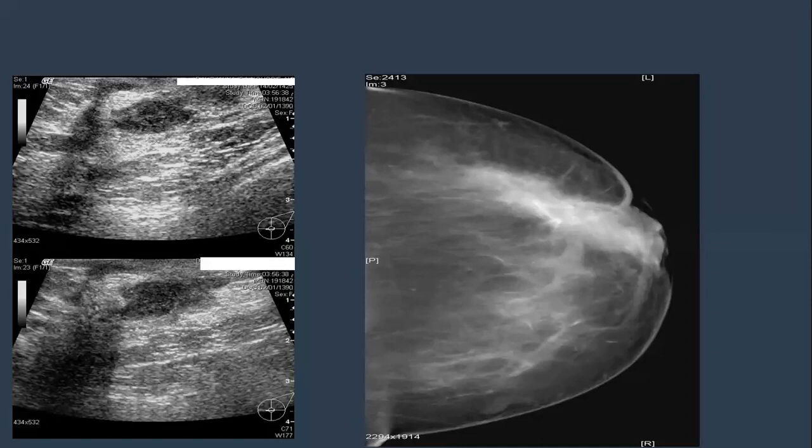Long standing. Long standing, associated with discharge. Post discharge.